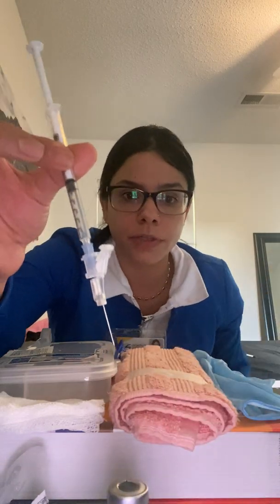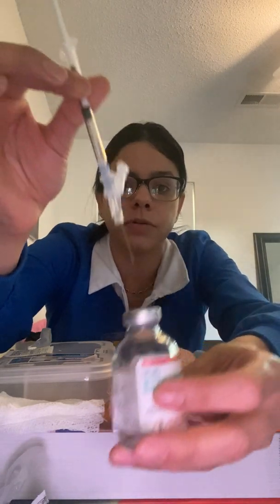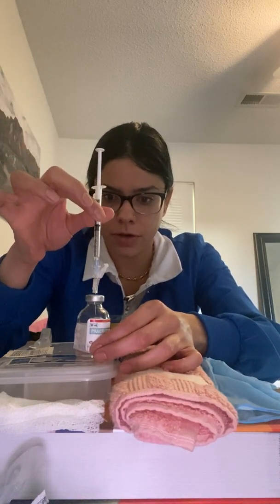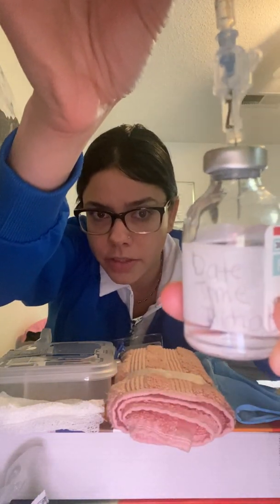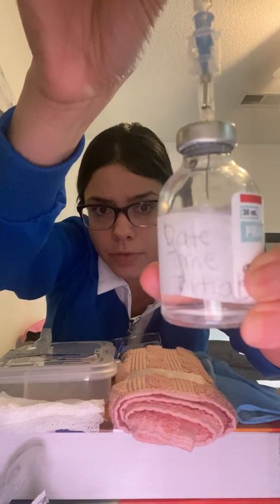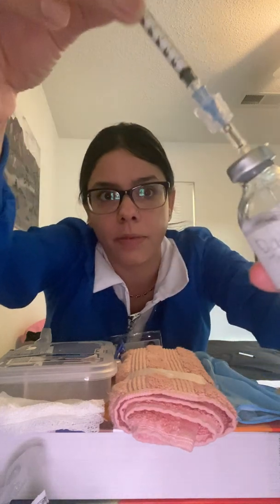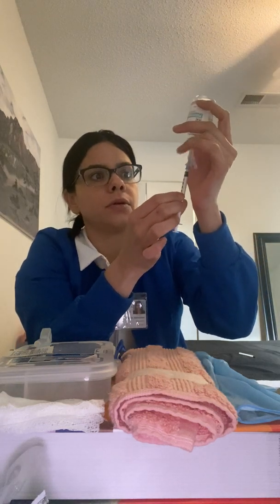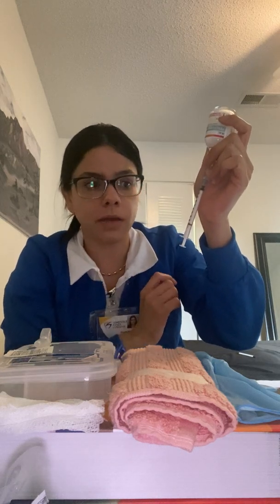vial, using air to air, which means that I am going to insert the air into the air part of my vial. So I'm going to do it right here. Insert. Hopefully you can see it. My needle is not touching the solution, and I am going to insert that air. Okay, now I am going to invert it, and I'm going to do this, and then I'll show you. And I am going now to draw 0.5 mLs of my medication.